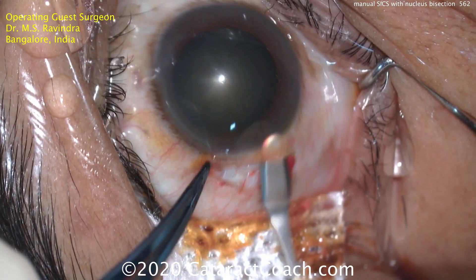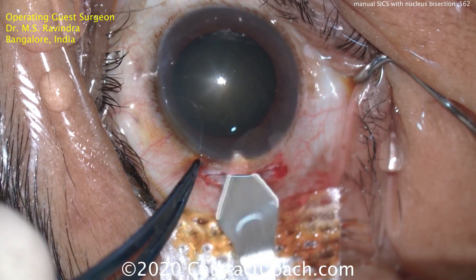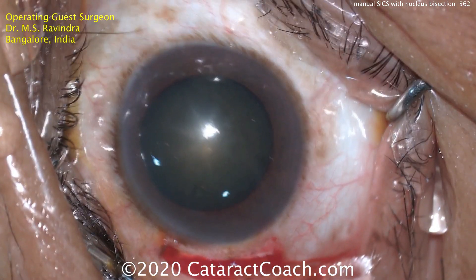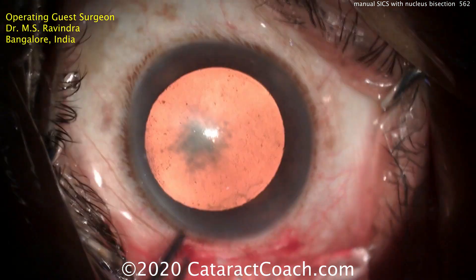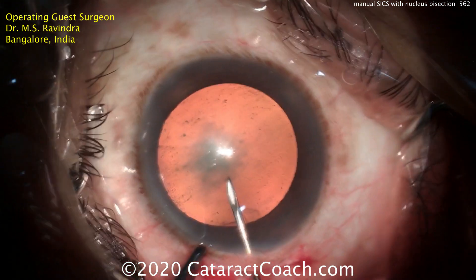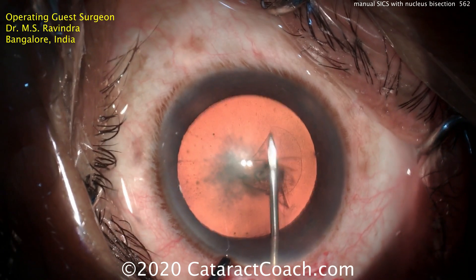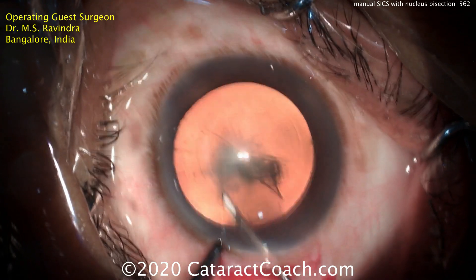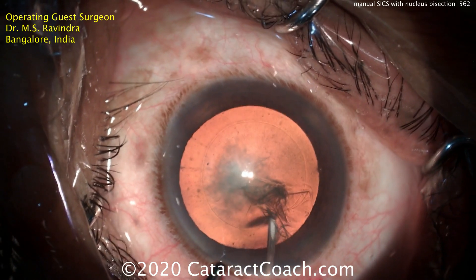The width on the outside is six millimeters, a little bit funnel shaped on the inside. With a keratome, he just barely punctures in a small incision of maybe two millimeters. In order to keep the eye inflated with viscoelastic — here's the red reflex now — he's using a cystitome to create a capsulorhexis. By only making the small incision first, it's much easier to keep the anterior chamber full of viscoelastic because he only has a two millimeter incision. A nice beautifully round five or five and a half millimeter capsulorhexis is being created, and that looks very nice.